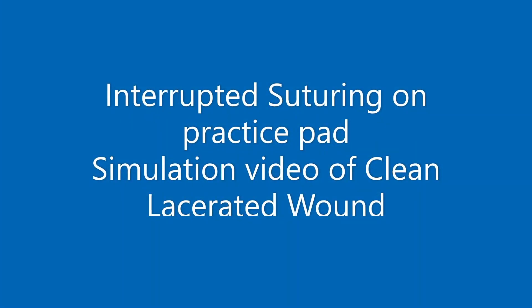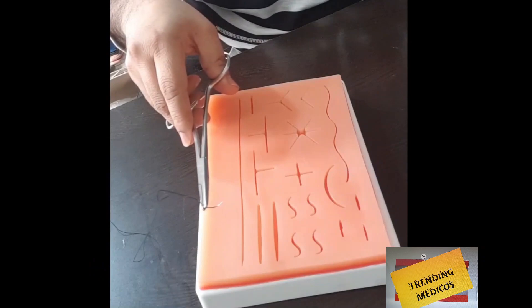Hello guys, today we will learn about interrupted suturing on a practice pad so we can make good sutures on real patients when we get them, like clean lacerated wounds. Let's start now.